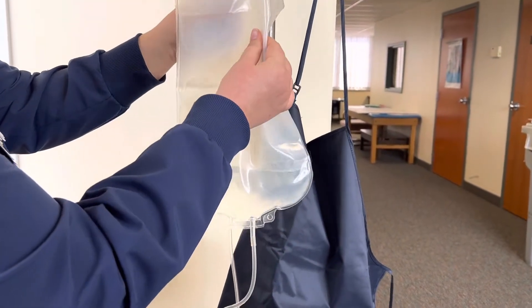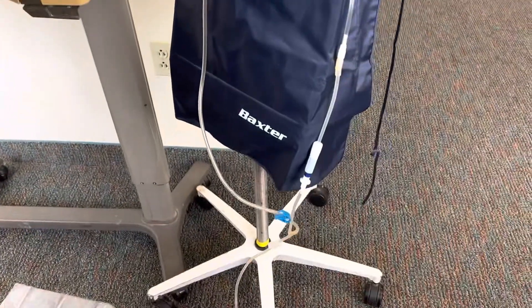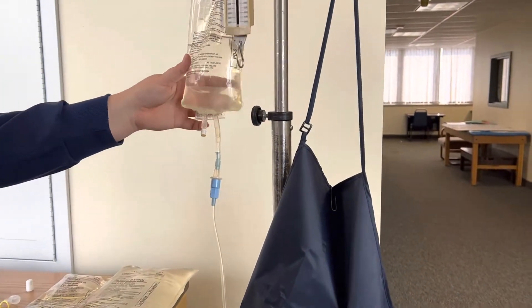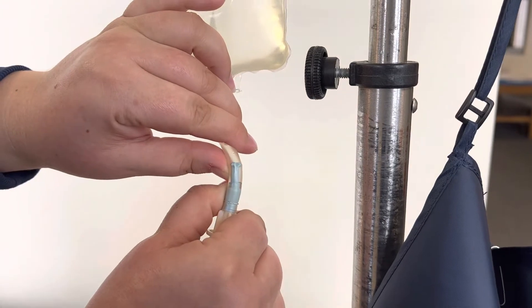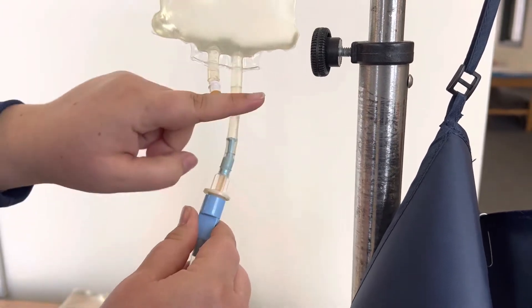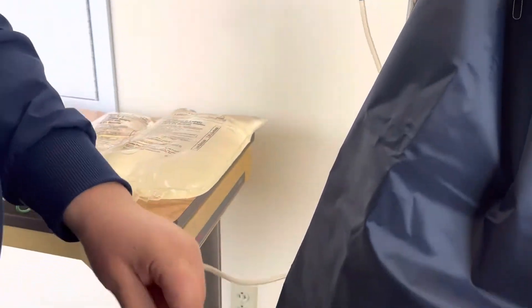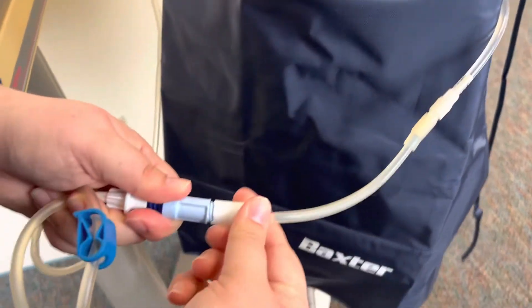Once it's weighed, take it back off the scale and now it's time to fill the abdomen with the new solution. From here you're going to crack that flange. Once it's all cracked, again make sure that it's not leaking.